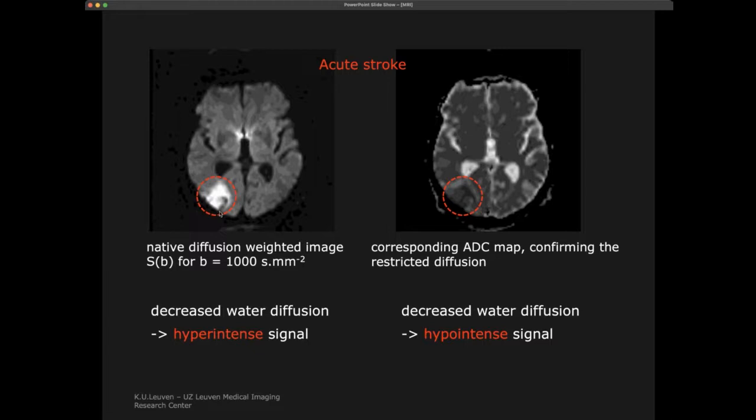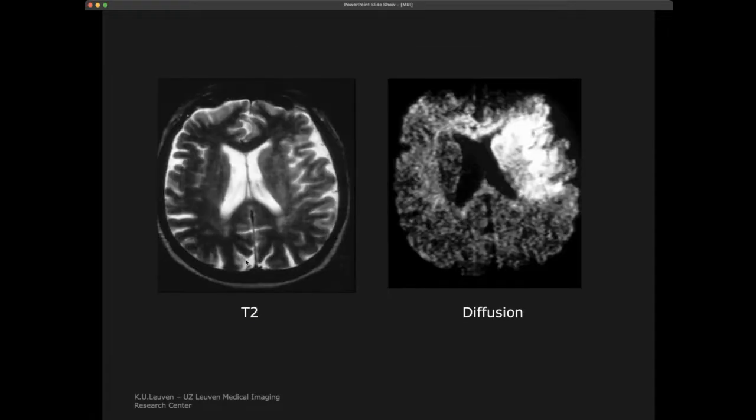For example, in an acute stroke, where you have a hemorrhagic stroke, we will see that locally the diffusion has changed a little bit, because we start to get thrombus, or coagulating blood. While the water content will be the same, the diffusion coefficient might be different. So that's another way to add more tissue characterization to what we're looking at.